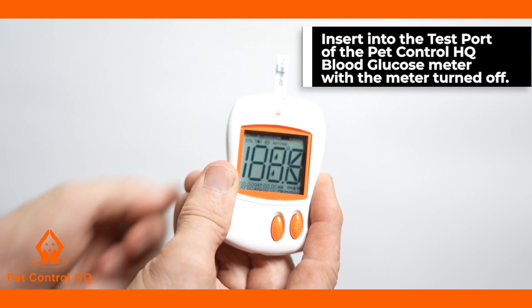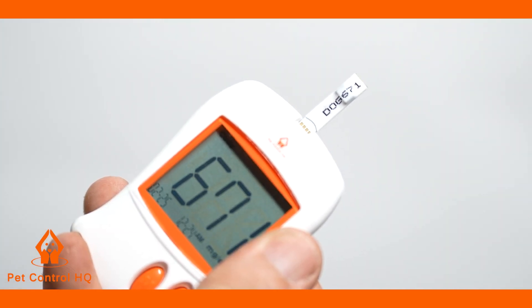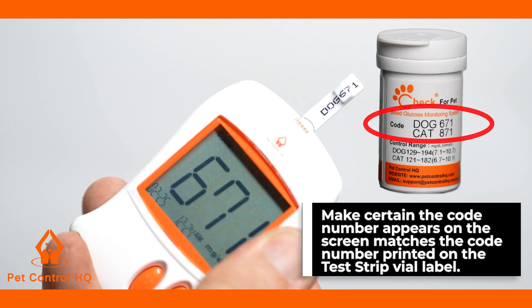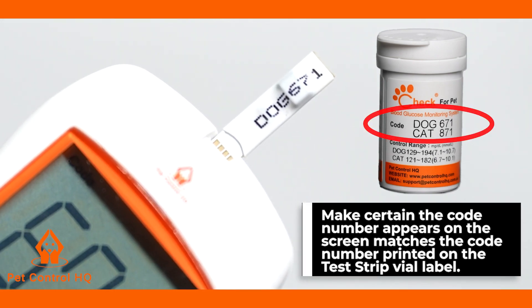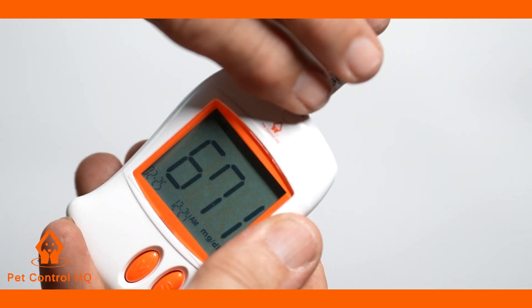Once inserted, the screen will display a CHK followed by a code number. You need to make certain the code number appearing on the screen matches the code number printed on the test strip vial label. Remove the code chip from the meter.